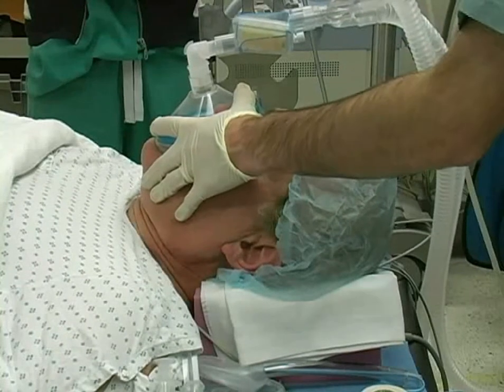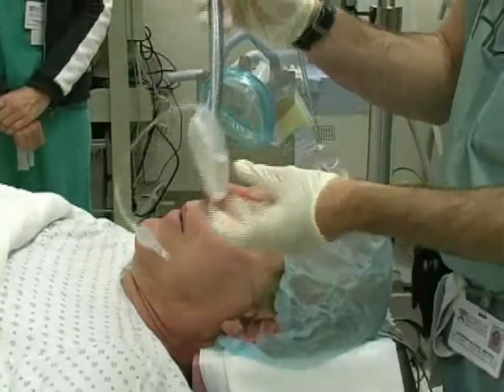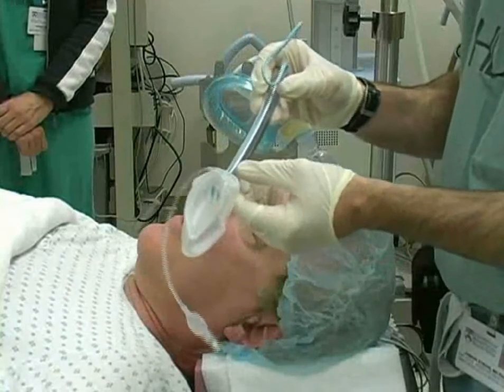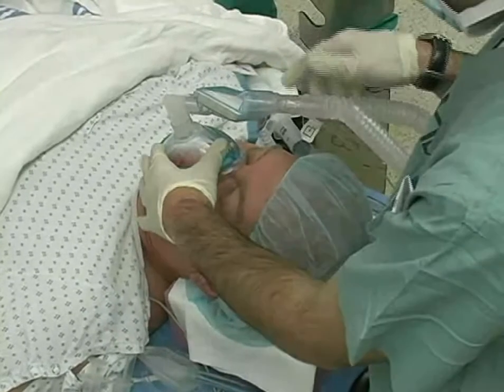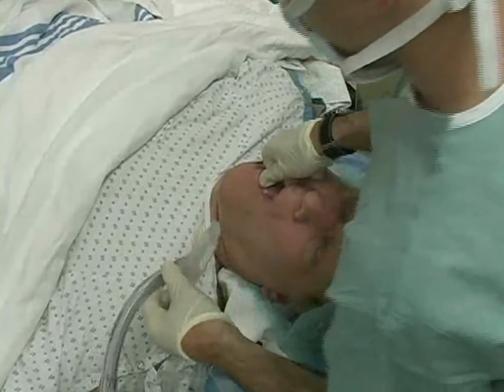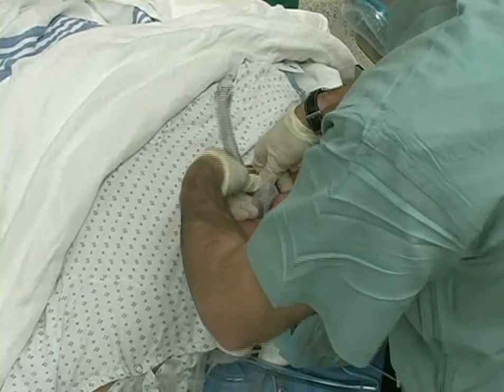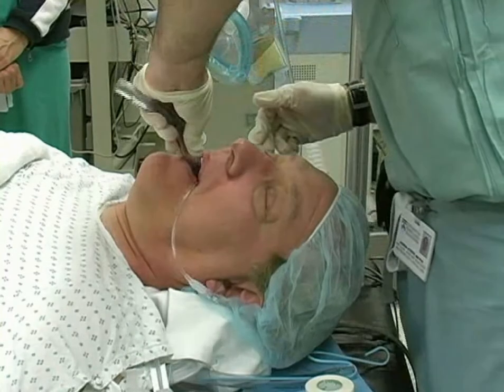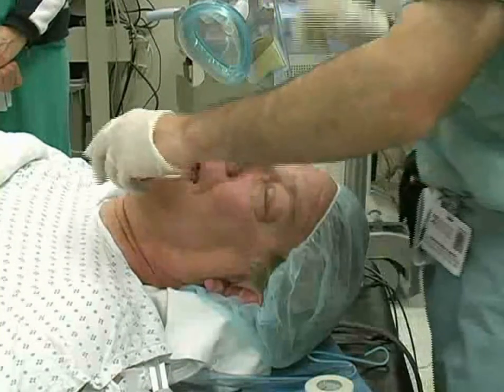In situations where placing an LMA is challenging, an alternative approach can be considered. First, a stylet can be placed inside the LMA; the stylet should not extend past the bulb. Alternatively, the LMA is inserted with the bulb facing upward. Sublux the patient's jaw and scissor the mouth open. Insert the LMA with the bulb upward until the entire bulb is located in the patient's mouth. As the tube is advanced, it is simultaneously rotated 180 degrees into place in the hypopharynx.